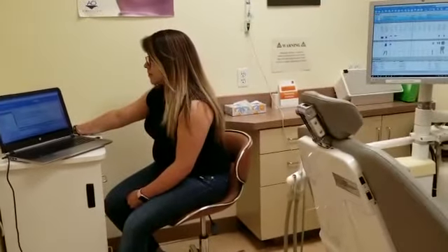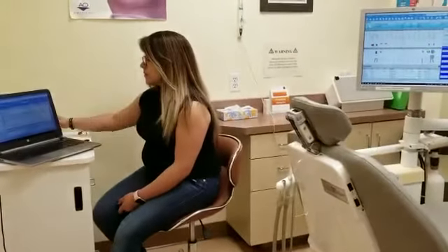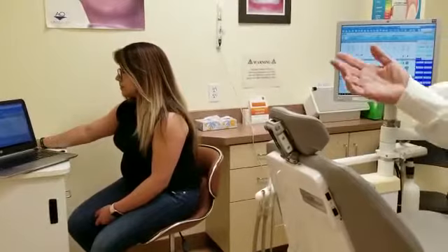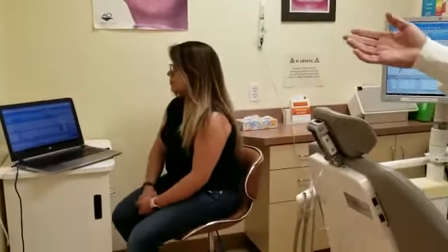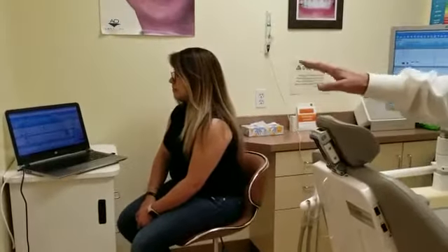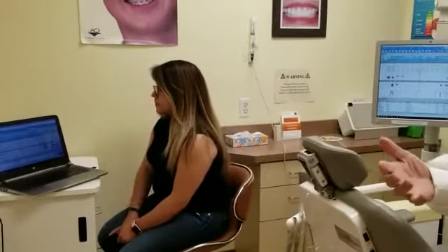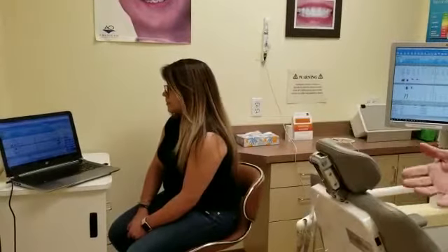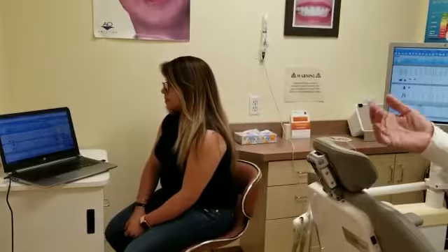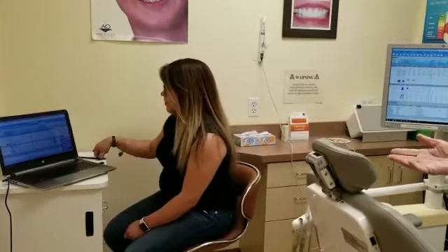Then when Amy tells me the progress notes are complete and the charting is complete, then I will give her the treatment plan. And she will be looking at the treatment plan and making sure that wherever there's something in red or pink, she will know that she should be expecting to hear me give her treatment for that, or a missing tooth. She should be waiting to hear treatment. So I'm going to be looking at this, and I'm going to be giving her the treatment plan.